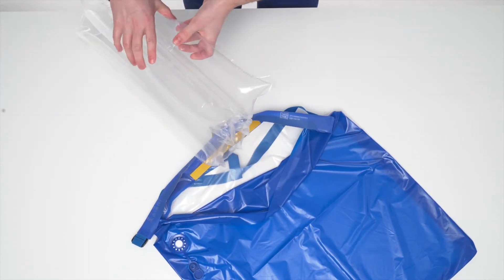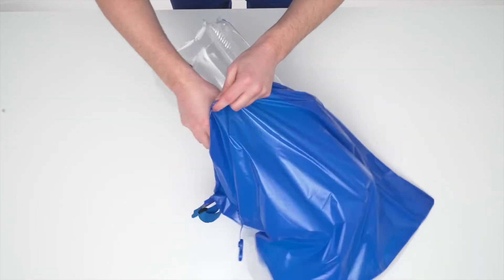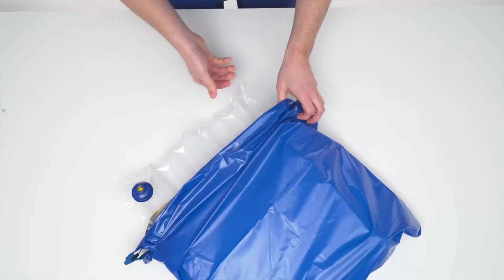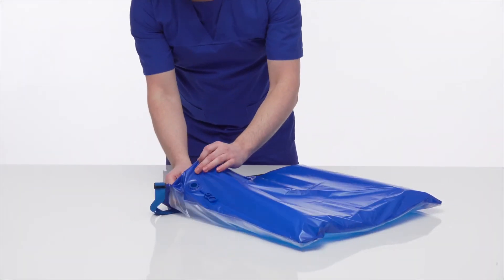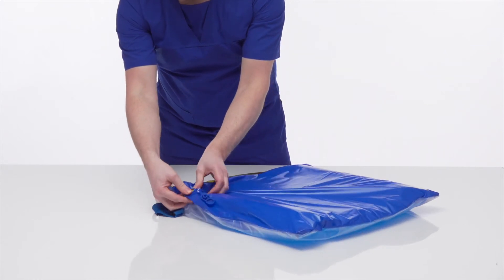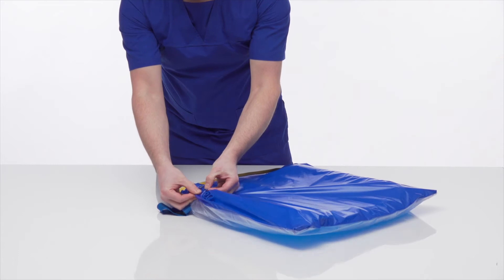Insert the inflated Repose Cushion into the Refresh Replacement Cover, ensuring that the inflation valve and blue shroud on the new Refresh Replacement Cover are aligned. Press the blue shroud down onto the inflation valve until it is securely fixed.